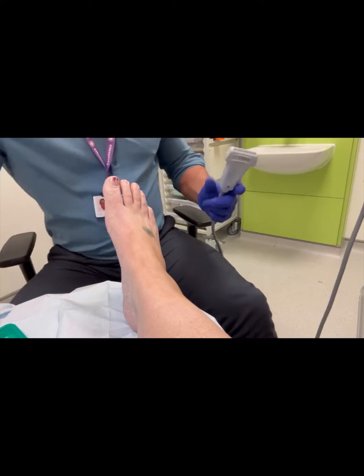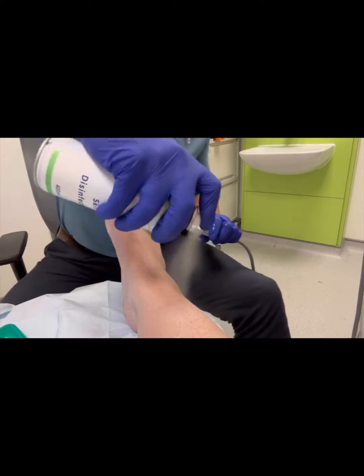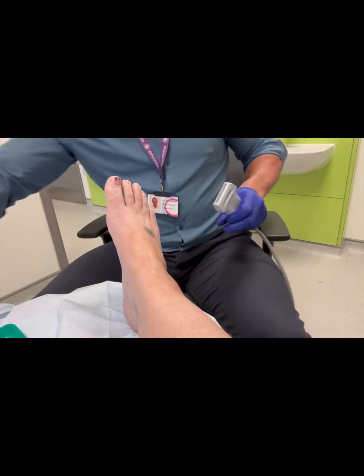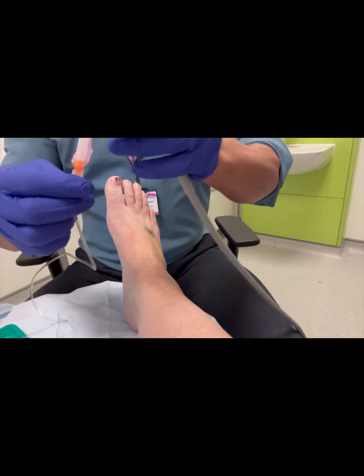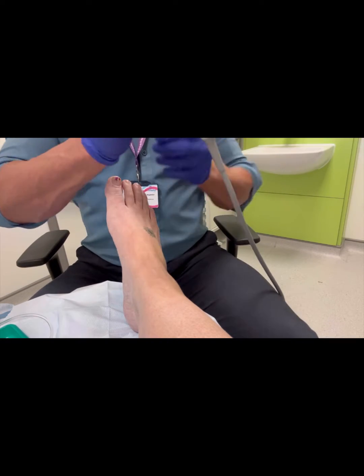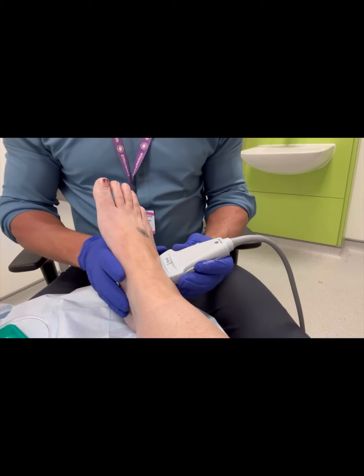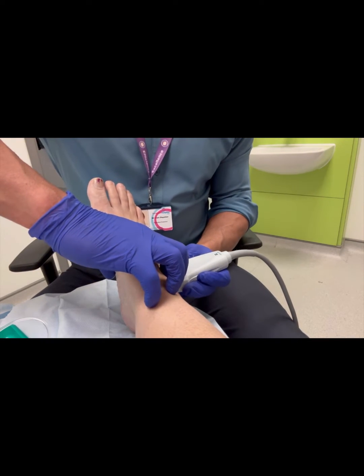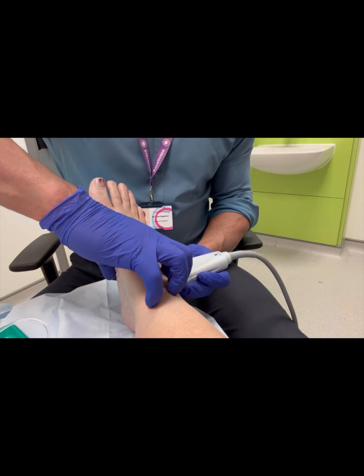Here we are performing a demonstration of corticosteroid and ostinol injection for subtalar joint osteoarthritis. The subtalar joint is the joint below the ankle joint which produces the rotational movement, or the side-to-side movement, in your ankle.